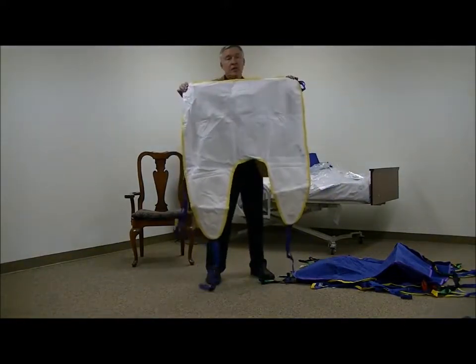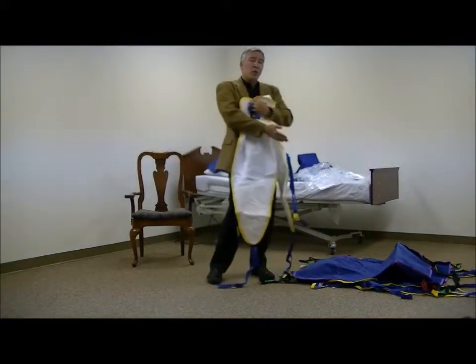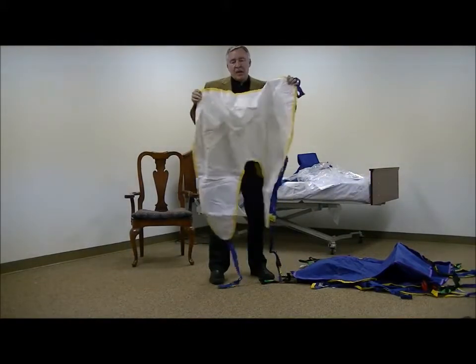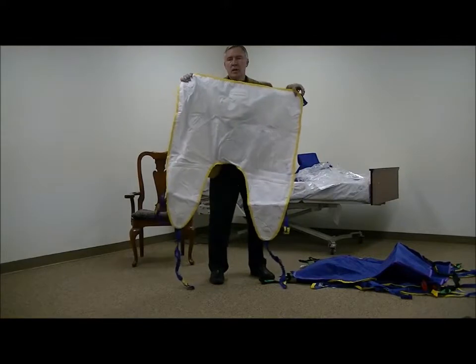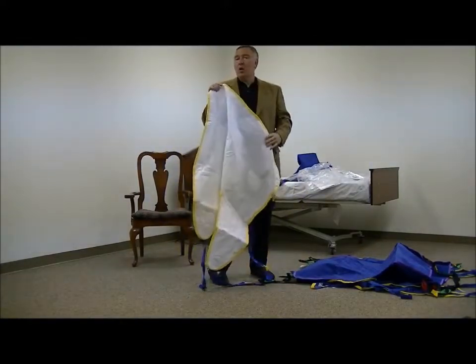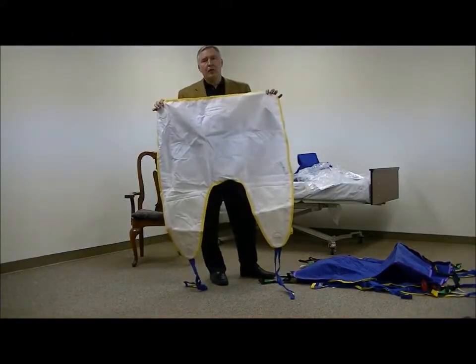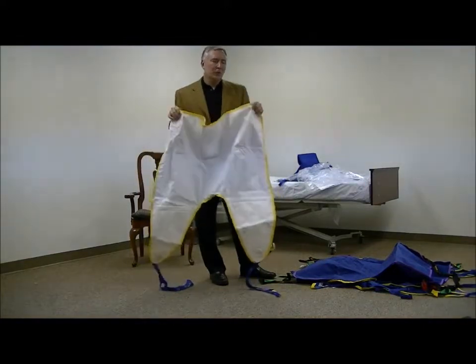It's also important to understand that these slings, if they're used on one patient, in some cases they can be removed and some people actually use them from patient to patient. That is a difficult judgment call to make because infection control is such a serious issue. If something were to happen and there were to be a cross-contamination from patient to patient, that could be a significant liability for a facility — and needless to say, it would affect the quality of life of the person the sling is being used on.